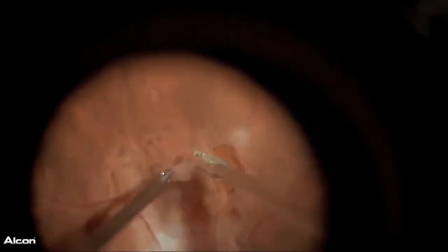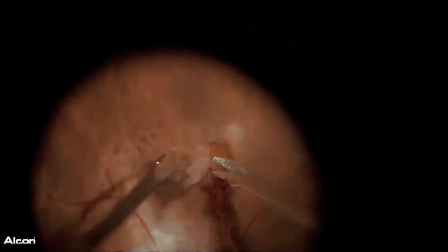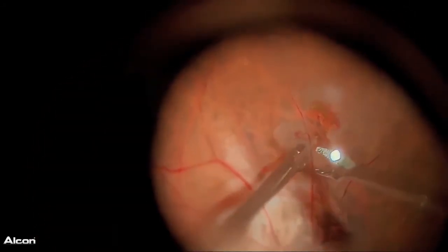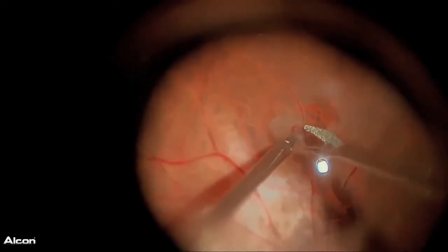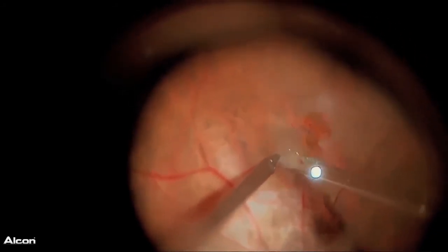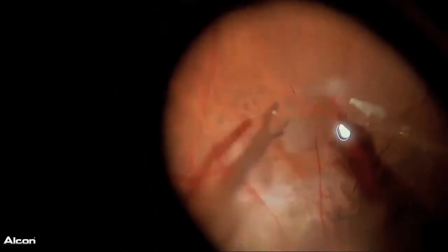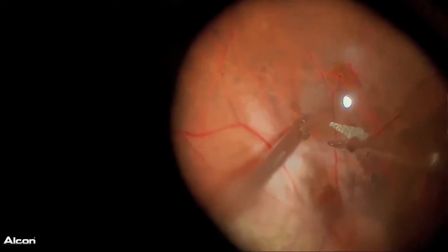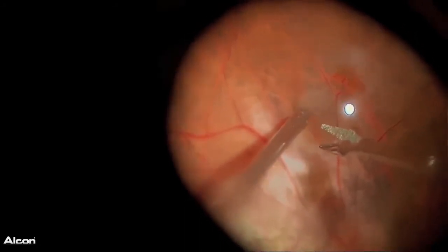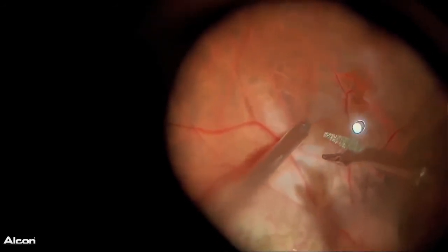So it's very difficult to harvest a small piece of retina. But I made a small piece of retina whose size is designed to be the same as the large macular hole. And I put perfluorocarbon liquid into this eye. The piece of retina is moved to the large macular hole with a bent forceps. I'm trying to grasp the piece of retina, and it's very difficult because the eye is large and too long.